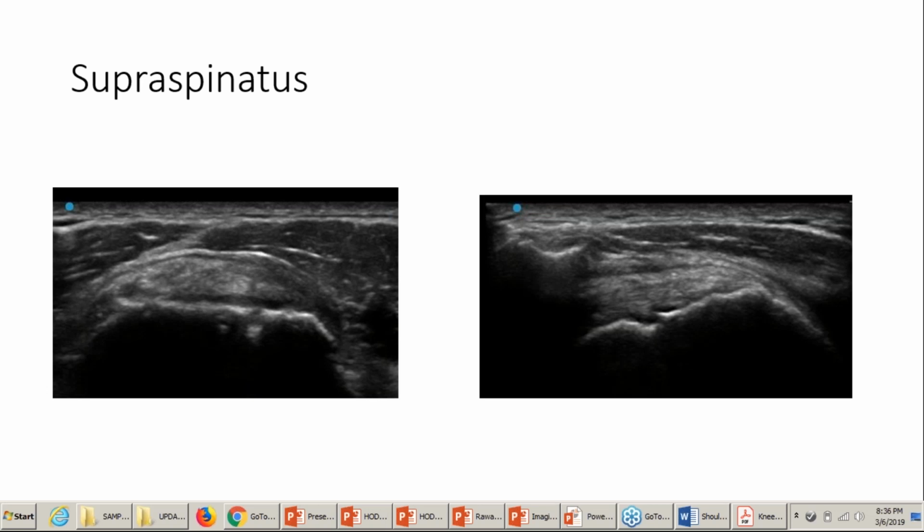Because what we're looking at is structure and how the structures look, but we don't necessarily look at the causal relationship. So it may not be the cause of their discomfort or functional limitation. So you need more than just 2 images to write that or say that. Make sense? Yes. Yeah. So we need more information. 2 images is not enough, but it does look like something which has been going on for a long time.